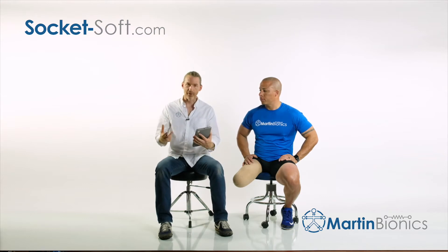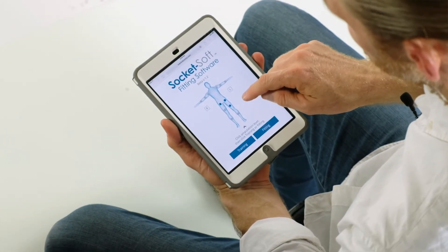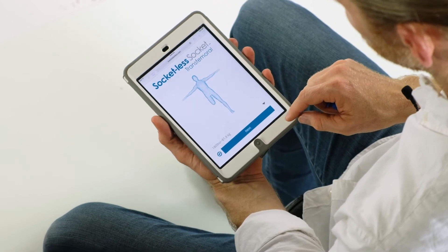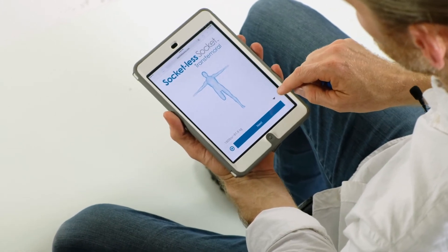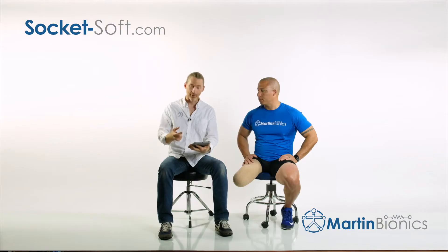Walking through SocketSoft is a very simple tool. I'm simply going to select the right transfemoral level, click on fitting, input the patient's weight, and click next.